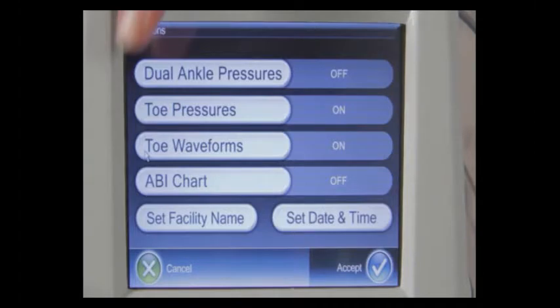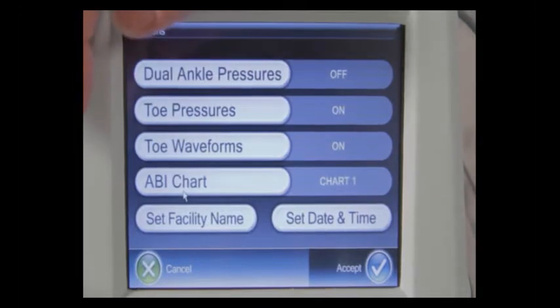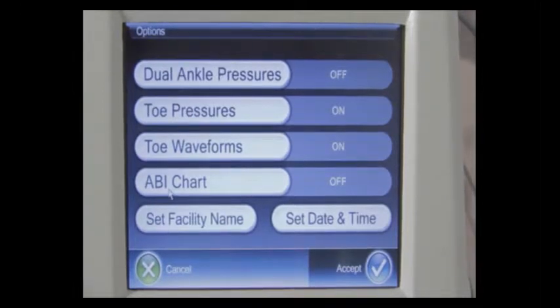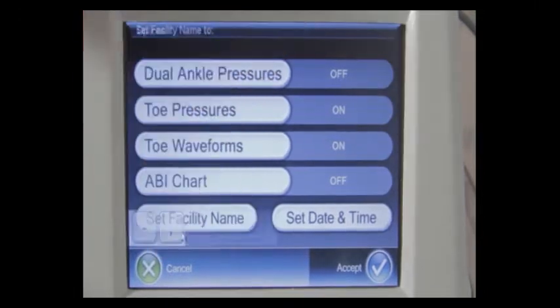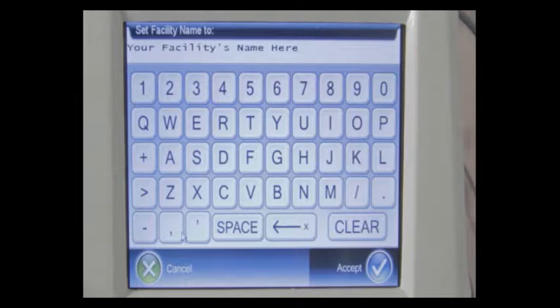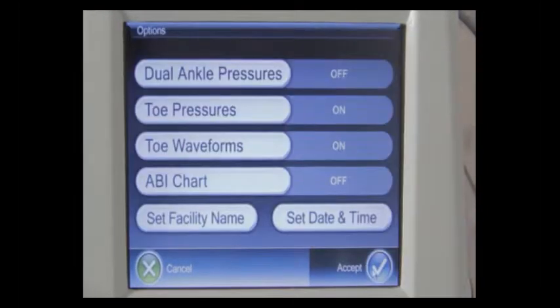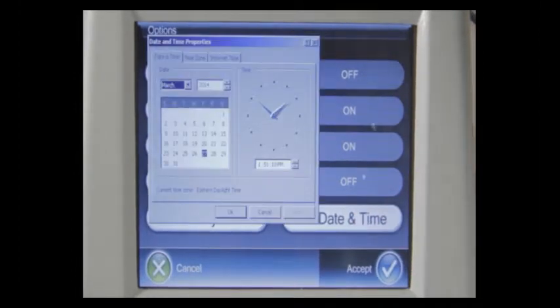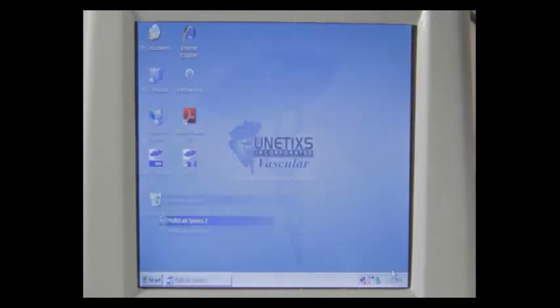The REVO system has two ABI charts. Chart one indicates that a normal ABI is 0.97 to 1.3. The second ABI chart puts normal at 0.90 or above. You also have the option of turning the ABI chart off — it will appear on your patient report. When you receive your REVO instrument, you'll want to set the facility name by pressing set facility name and using the on-screen keyboard. You can adjust the date and time by pressing the set date and time button and adjusting the Windows clock. When you press the accept button, your configuration settings will be saved to memory.